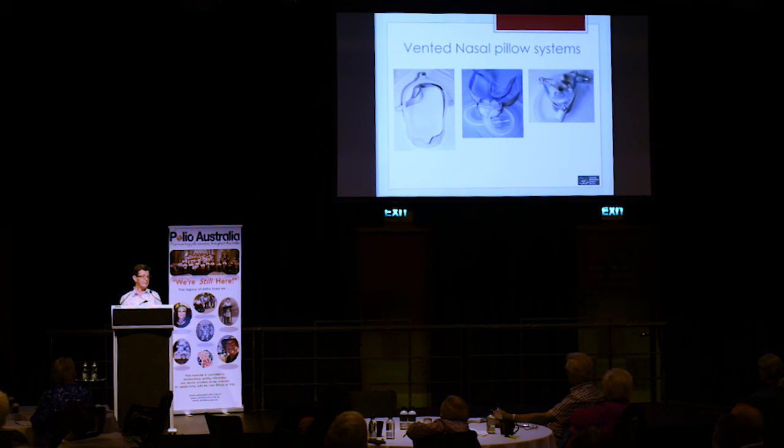Any nasal system used in the presence of an open mouth would result in the person not being ventilated, because the air would go up their nose and just come straight out of their mouth. So, no air going into the lungs.